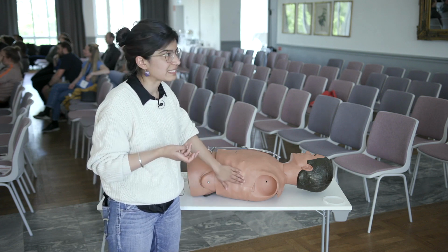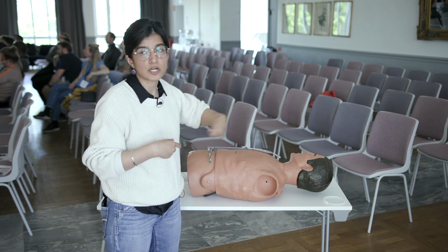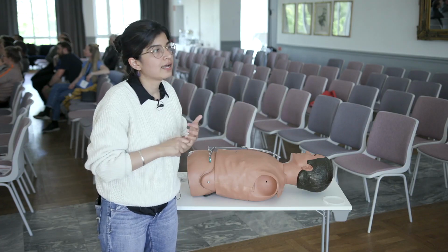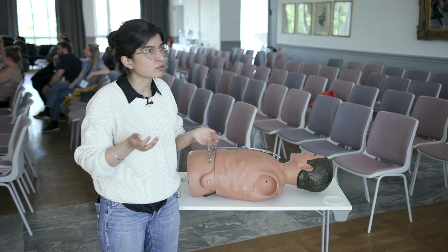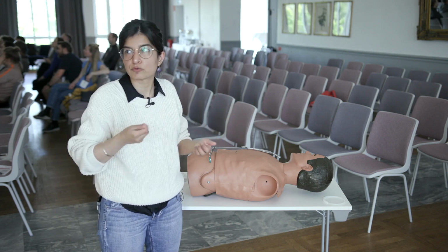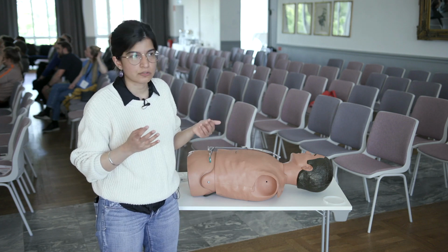I give a little skin wheel because there are 3 major areas that hurt on chest tube insertion, right? So anyone want to throw them out? Skin, perfect. Periosteal, yes, exactly. And the pleura, exactly. Those are the big 3, right? The sub-Q is very well tolerated. If you have a super muscular person, going through muscle can be difficult and painful, so just be mindful of that as well.